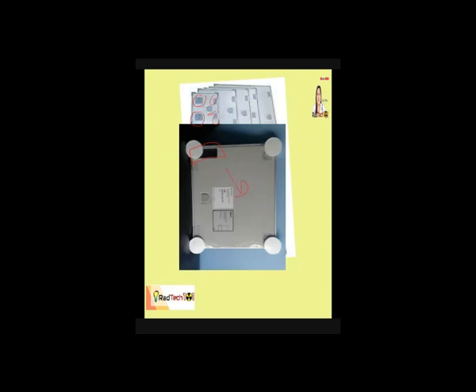So this is the back part, and the front part will also be facing the patient. So the marker side must always be on the right side of the patient. Okay, remember, the marker of the radiographic cassette must always be on the right side of the patient.